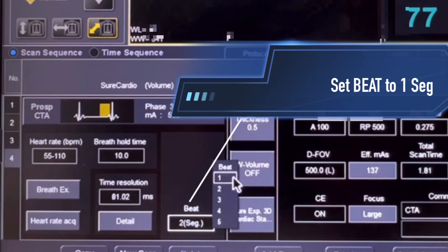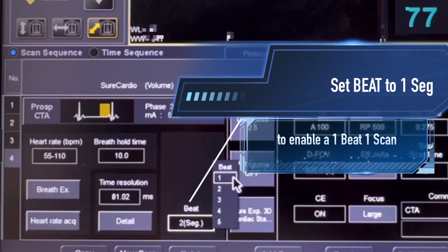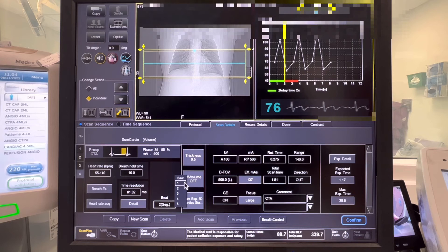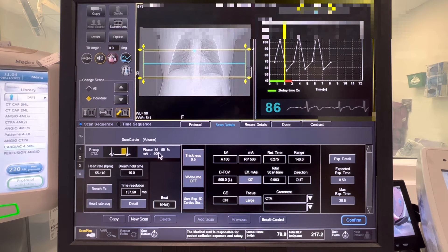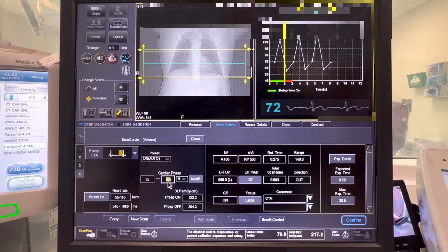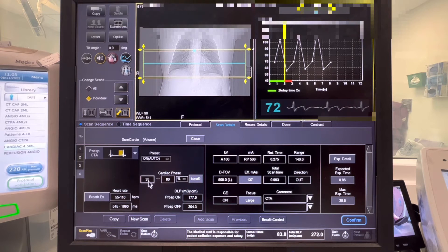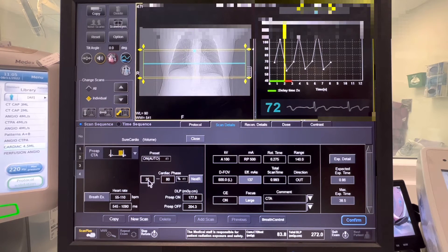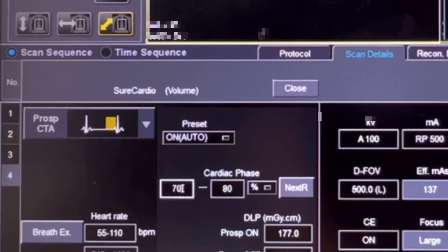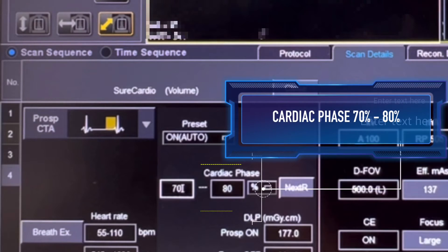First, we are going to change the beat segment from two beats to one beat only, so we can scan the whole heart in one rotation — we call it one beat, one scan. Then change the cardiac phase parameters to 70% up to 80% phases.